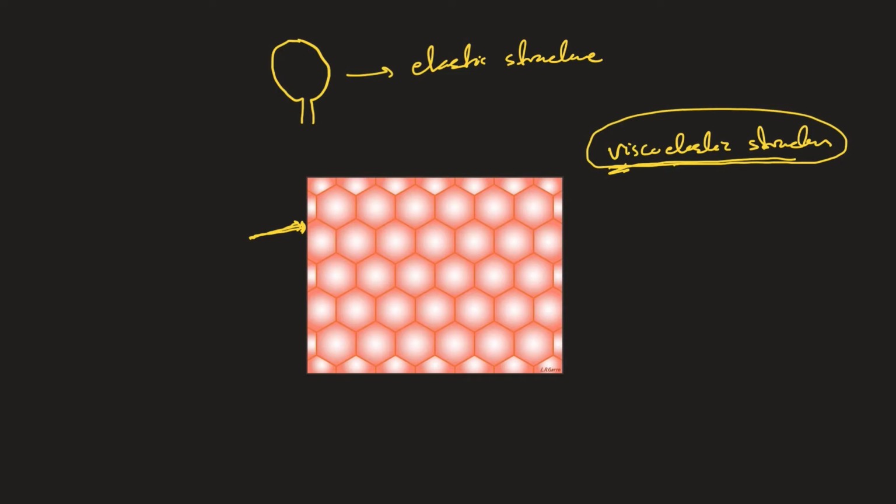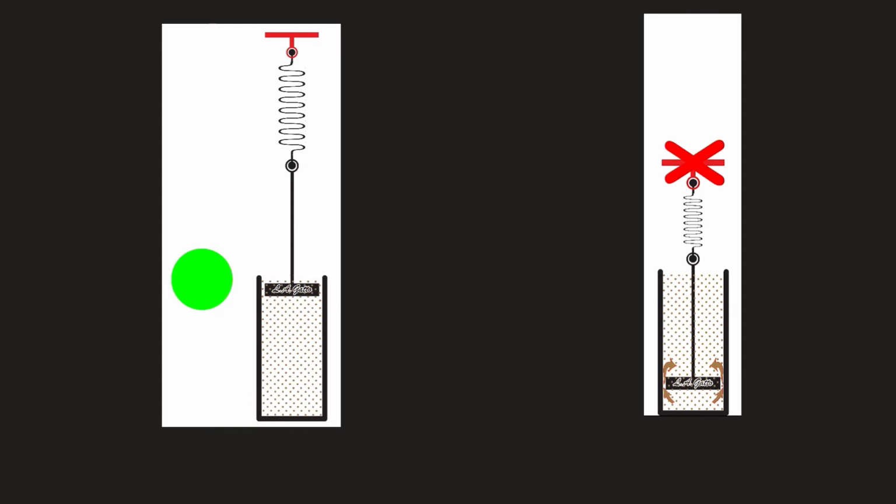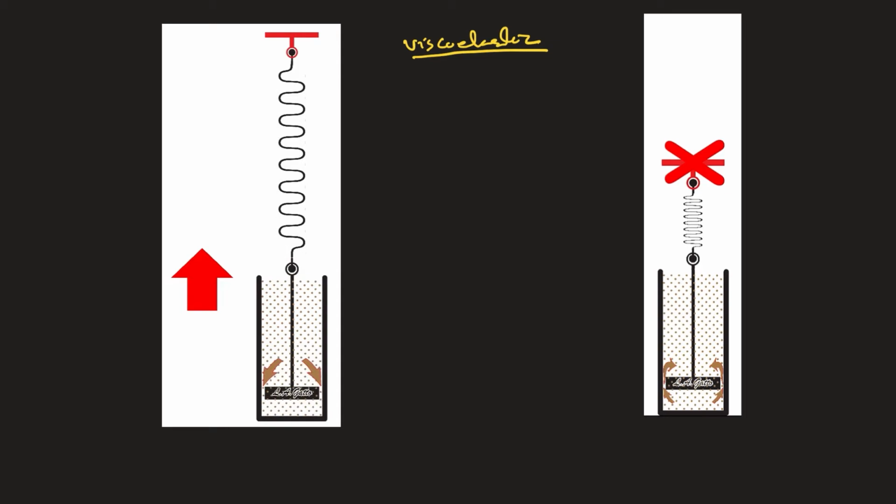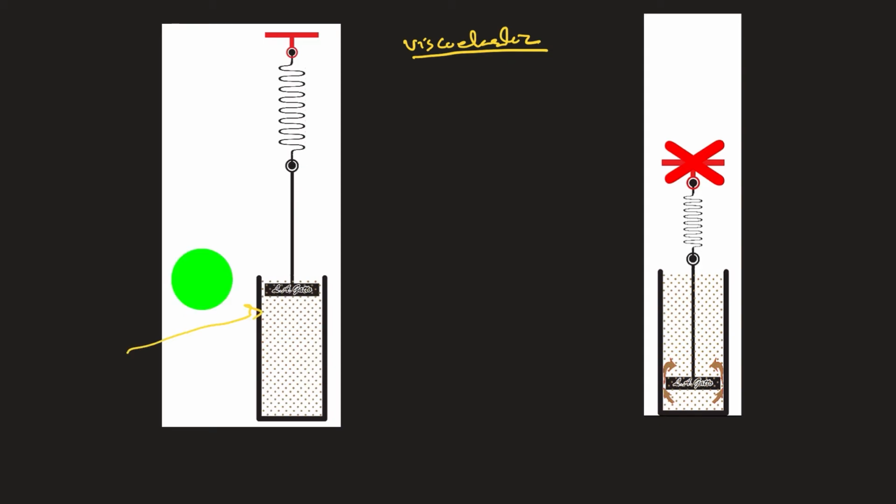And to make it clear for you, let me show you a couple more videos. This is the spring and dashpot example to really clarify the viscoelastic structure of the alveoli. Okay, so look at this here, the spring and dashpot example. I'm going to play this movie now. Look, the spring goes up. The spring represents the tidal volume. See how quickly the spring goes up? Look at the dashpot here, slowly coming up.